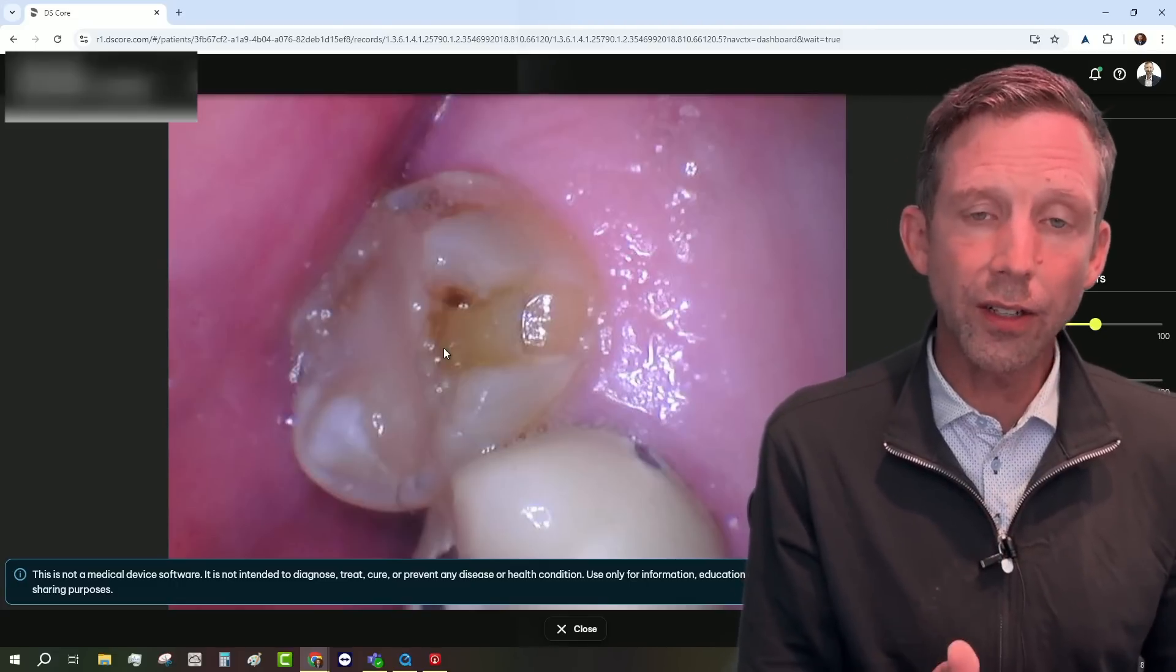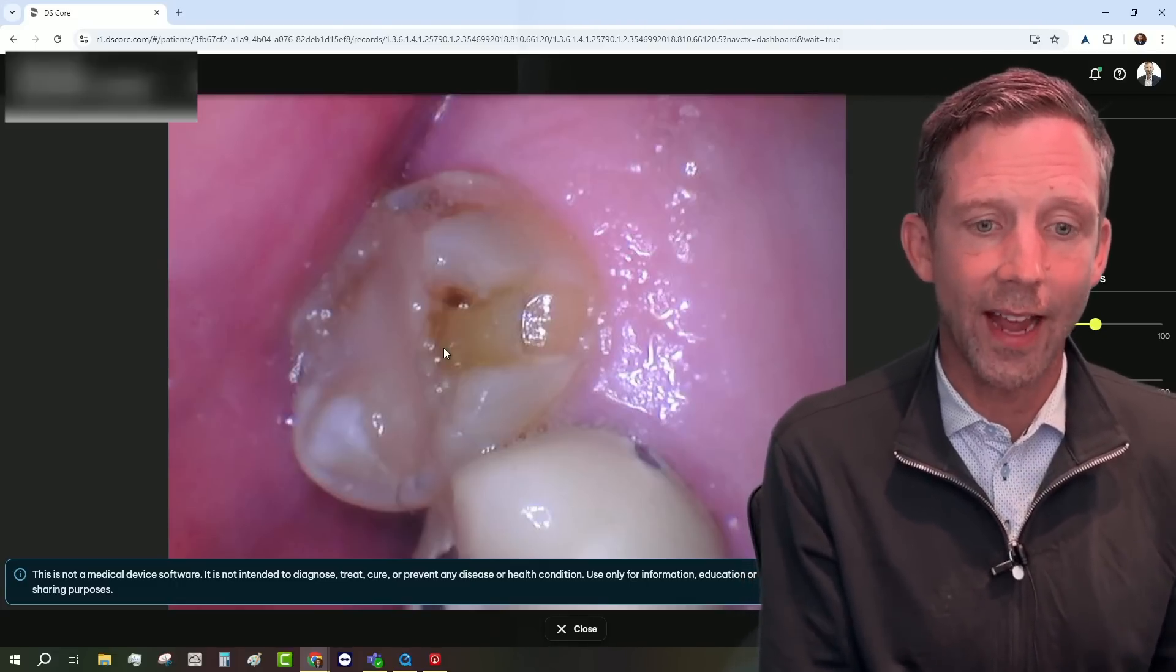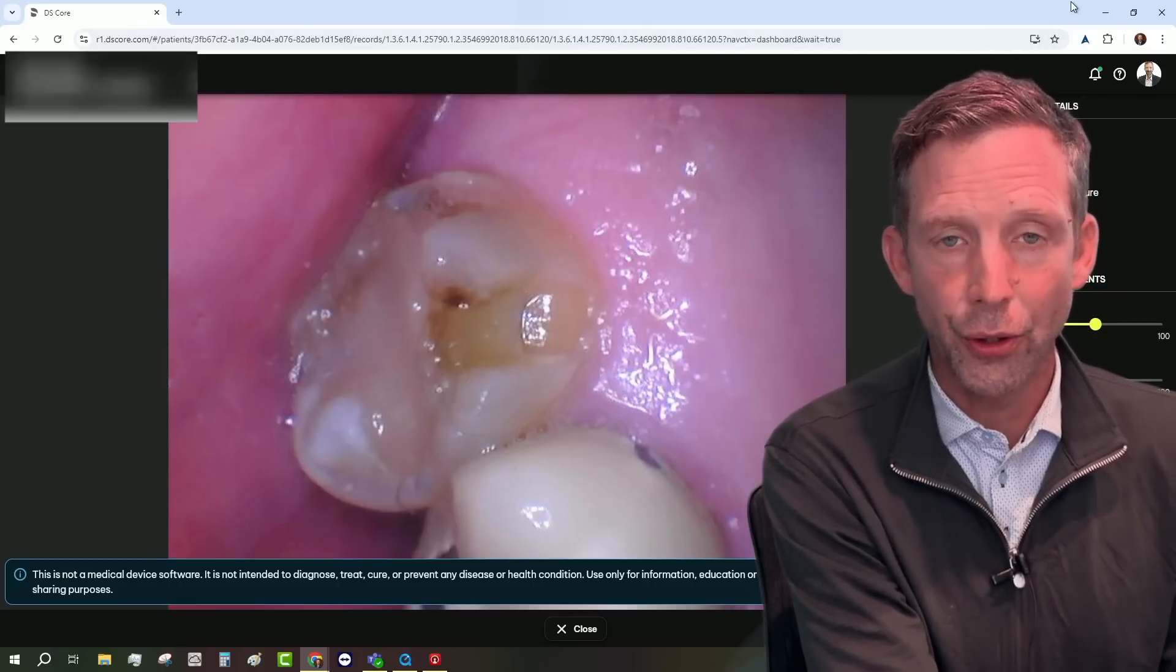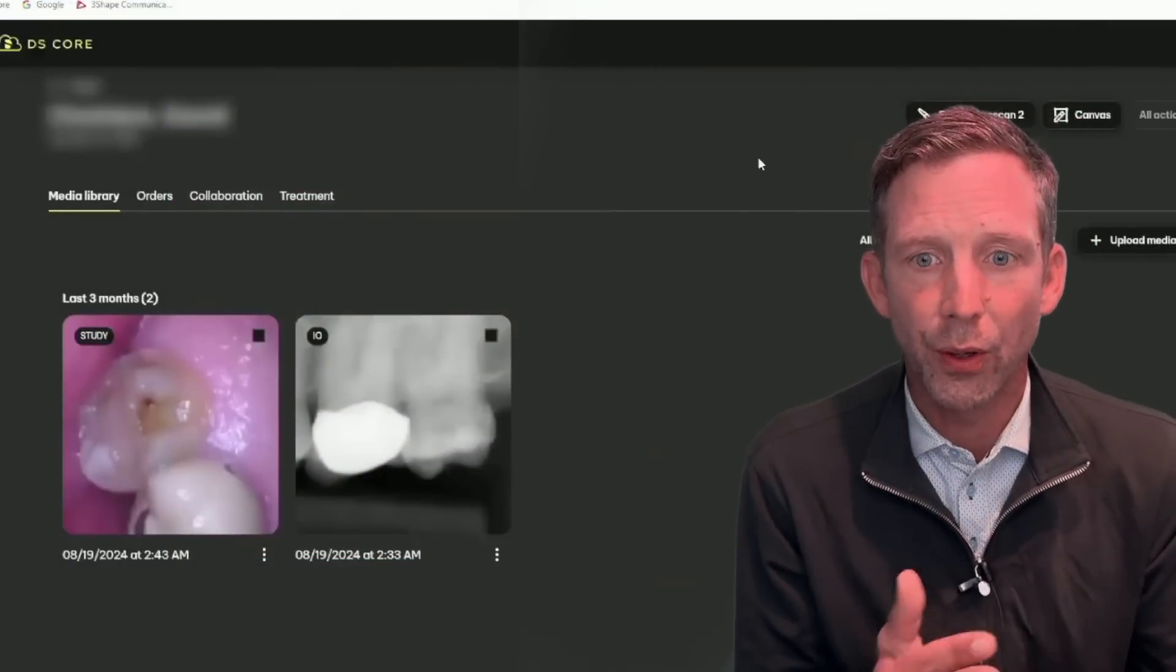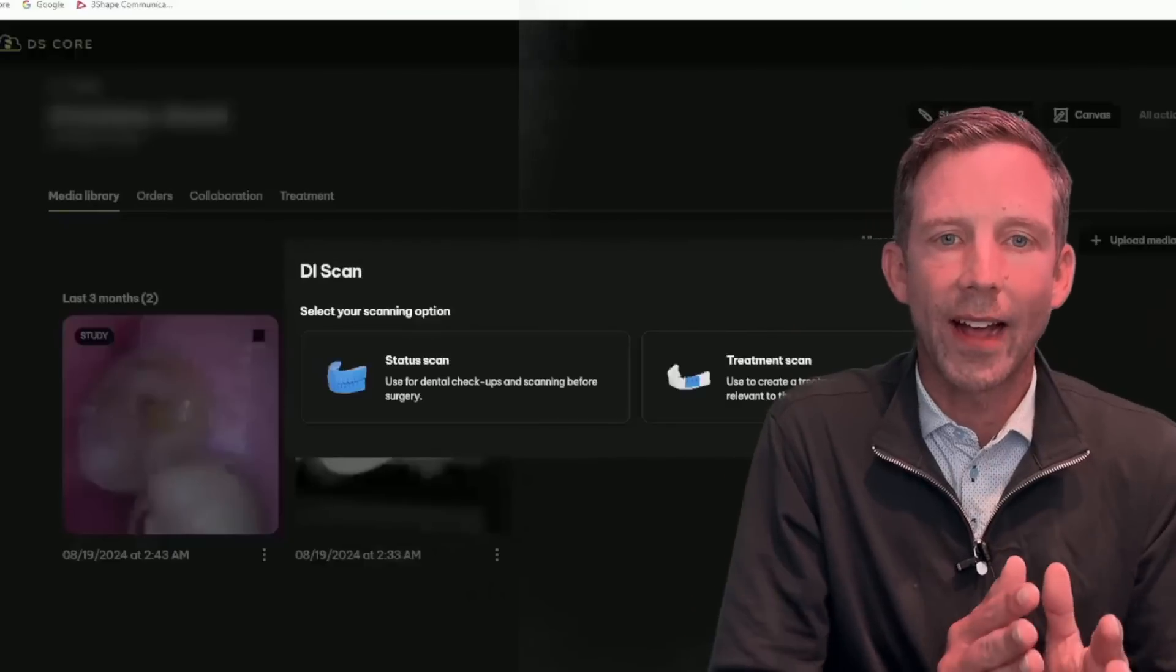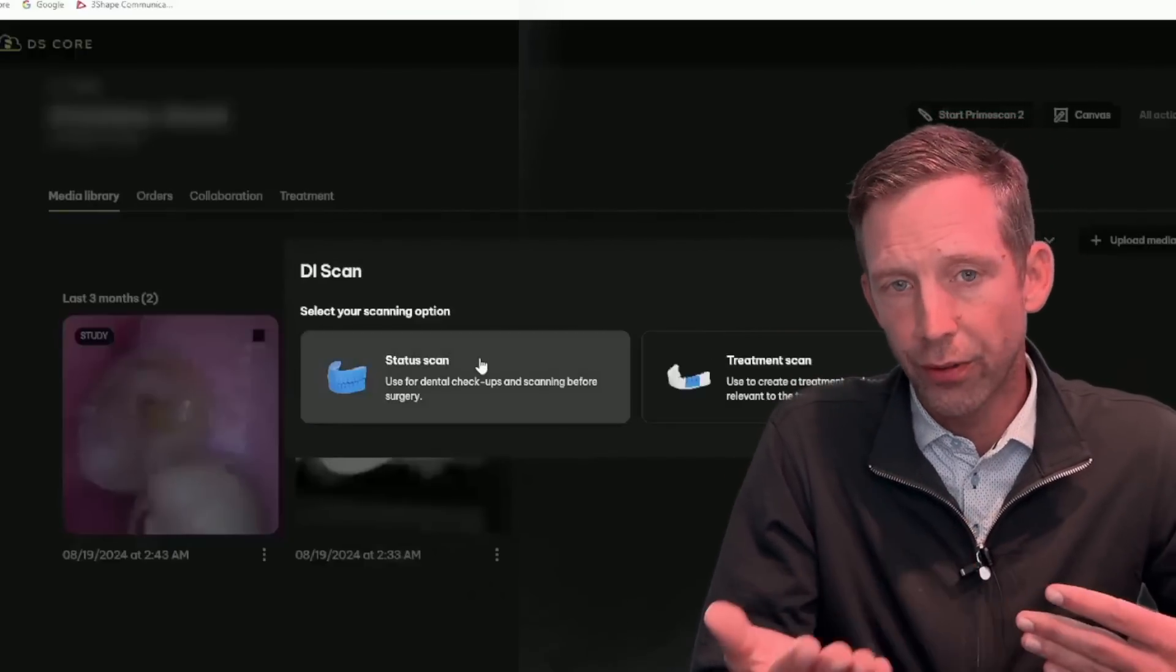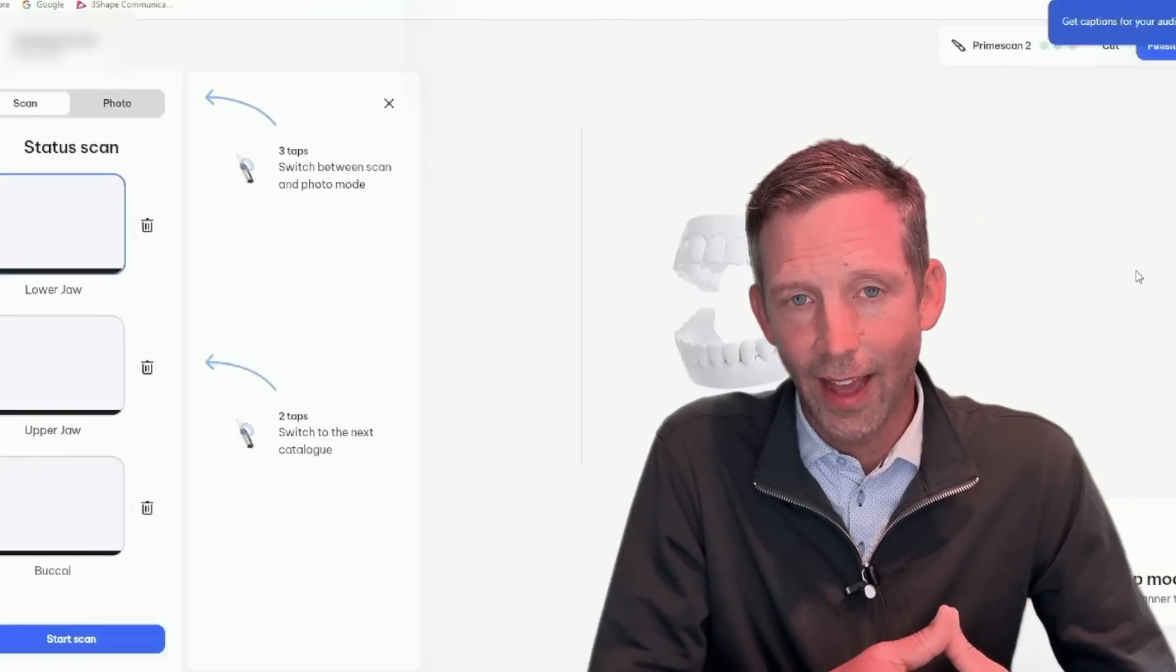So what I started with on this case is we actually are going to start with a status scan. So let me bring this up to show you what we did. So the very first thing that we're going to do is we're going to start the PrimeScan 2. It's going to ask us, what would you like to do? Do you want to do a status scan or a treatment scan? We're actually going to choose status scan.